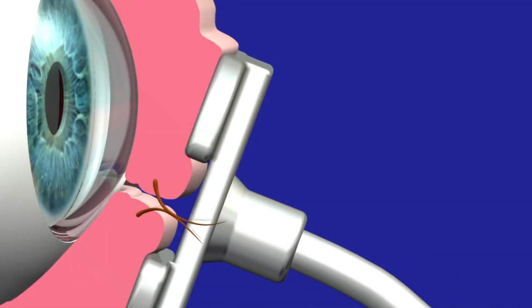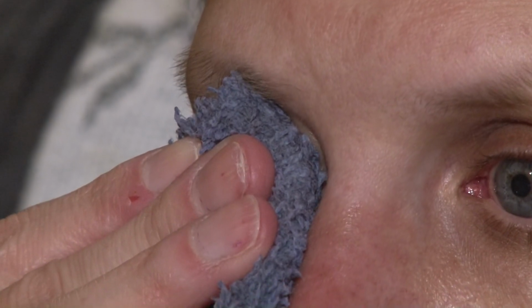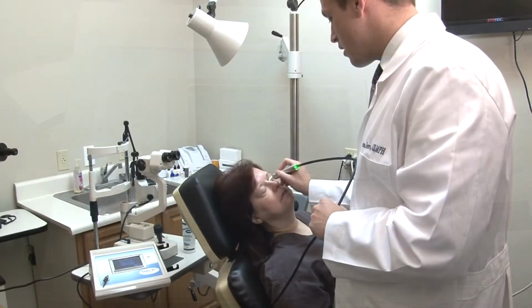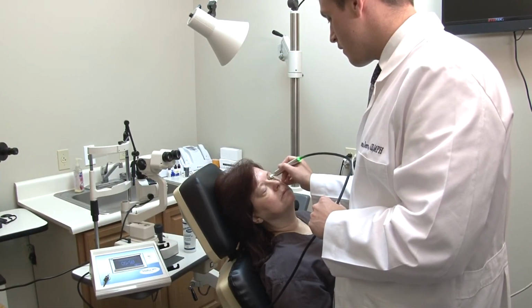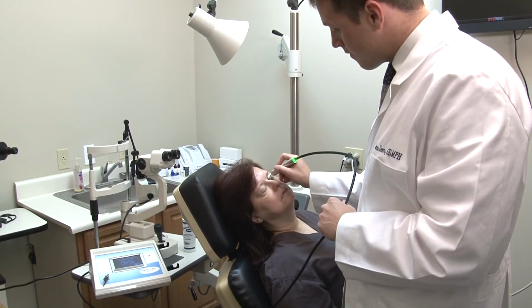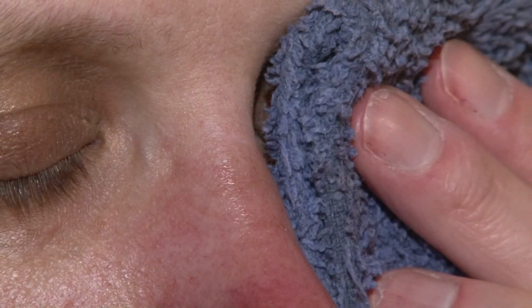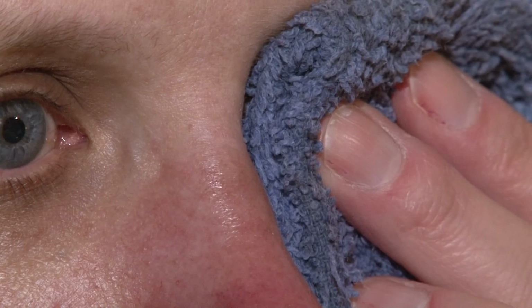I like to liken it to regular dental hygiene appointments. Warm compresses at home are good, and they're like flossing your teeth, but you cannot replace brushing your teeth and flossing them with regular hygienist appointments, because they're able to clean your teeth much more effectively. Patients get this, and they get that if they do nothing, the condition gets worse. So many times we will have the patient try the warm compresses and lid scrubs and recheck the glands. If there is little to no change, then we know, and the patient knows, we need to do something more effective.